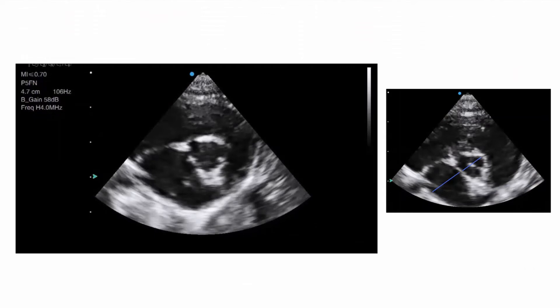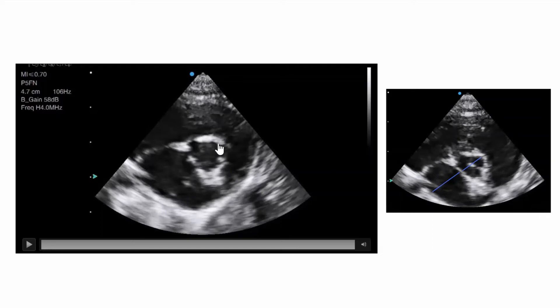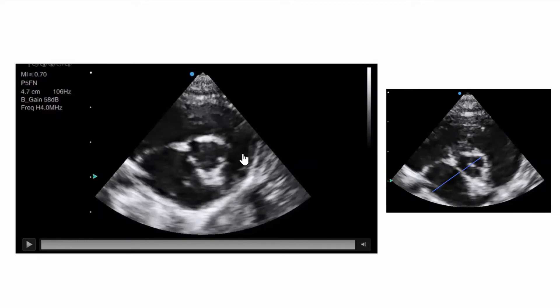The idea is that you pick the first frame when you see the aortic valve is closed, and you measure through the middle of the right coronary cusp, following the join between the left and non-coronary cusps. The non-coronary cusp is always going to be the one where the interatrial septum is. From there it's a process of elimination: the right side of the heart is more anterior, so this is the right atrium, this is the right ventricle and right ventricular outflow tract — which means this must be the right coronary cusp, this is your left atrium, and this must be your left coronary cusp.